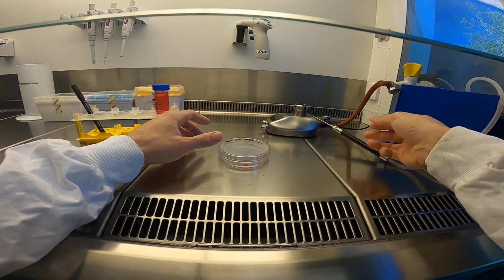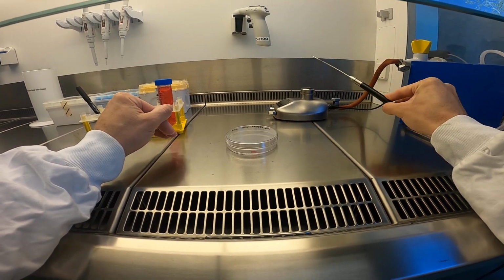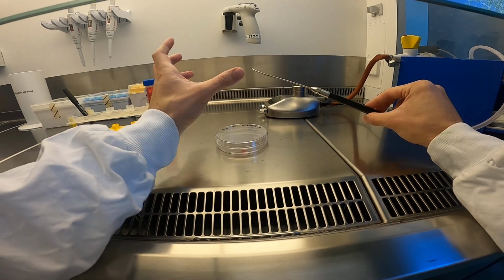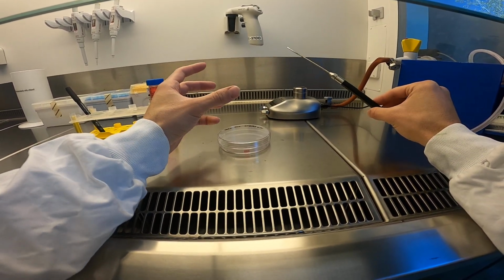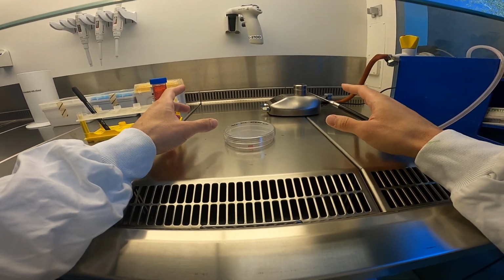Then we put the needle down, and do not sterilize the needle now. Do not put it on the flame. The reason for that is because you have cells and proteins in there, and because of the heat they will start aggregating, and then you might actually block the tubing. So we don't want to do that.